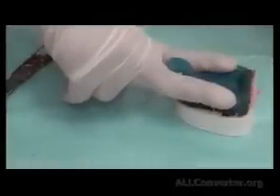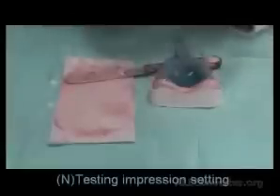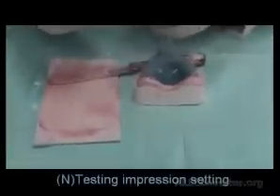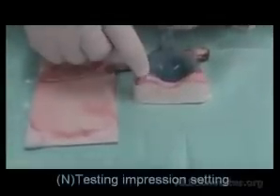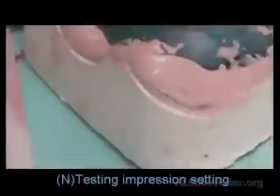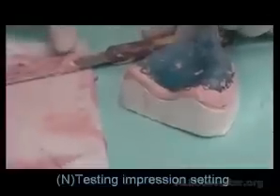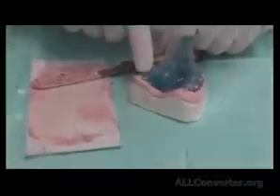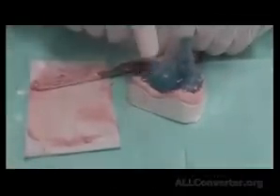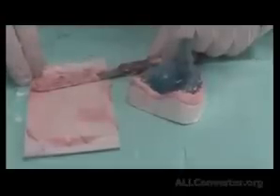So while waiting for the material to set, we need to do border molding movements inside the patient's mouth. We need to test that it's set. So we do our finger test, where with our fingernail, we just press into the impression. If my fingernail leaves no mark, that means the impression is set. Also, I could use as an indicator the spatula material. If the material is set here, definitely it's in the mouth more set, because the mouth is more warm. So we make sure that the material is set before we remove it from the patient's mouth.